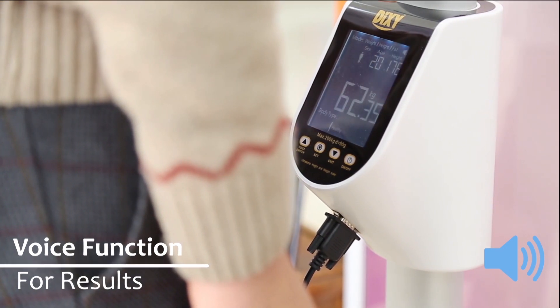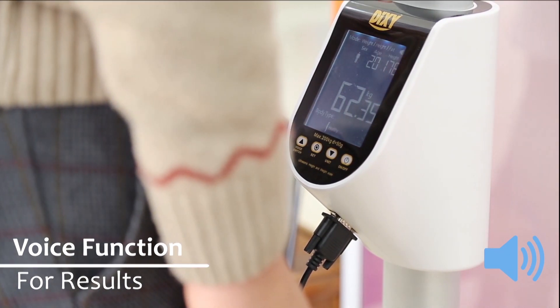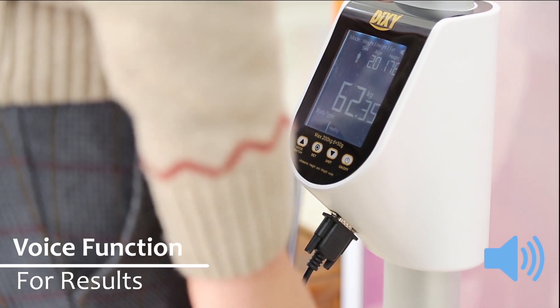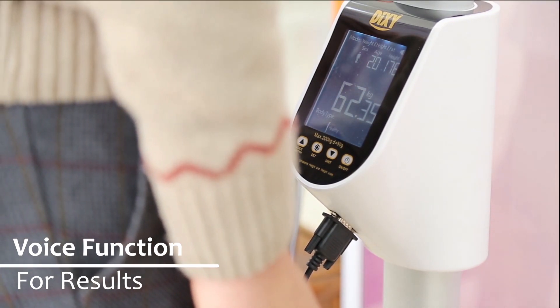Your height is one hundred and seventy six centimeters. Your weight is sixty two point three five kilograms. Your body type: standard.